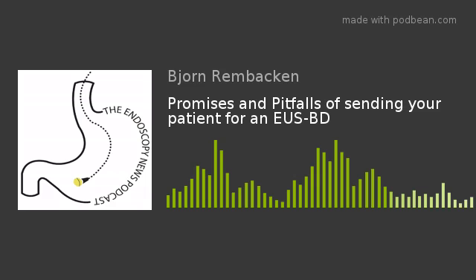Patients who are precluded from intubation with an endoscope, for example, those with head and neck cancer with severely altered head and neck anatomy, and those who are profoundly coagulopathic or thrombocytopenic, but those particular facets can be overcome by correcting those numbers prior to the procedure. The bile duct, most importantly, has to be sufficiently dilated to allow the procedure to take place.